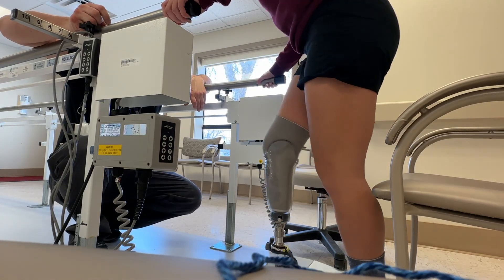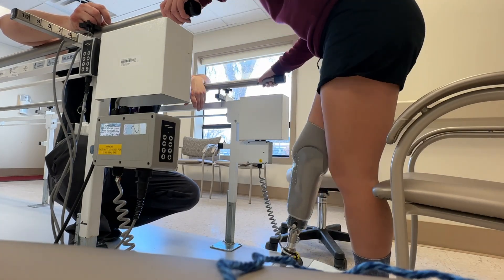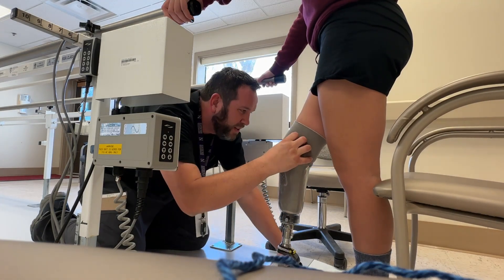My name's Tiffany. [Click, click, click, click.] I think I'm in. Actually, that looks pretty snug. Are you feeling anything yet? No. Anything biting, pinching? No.